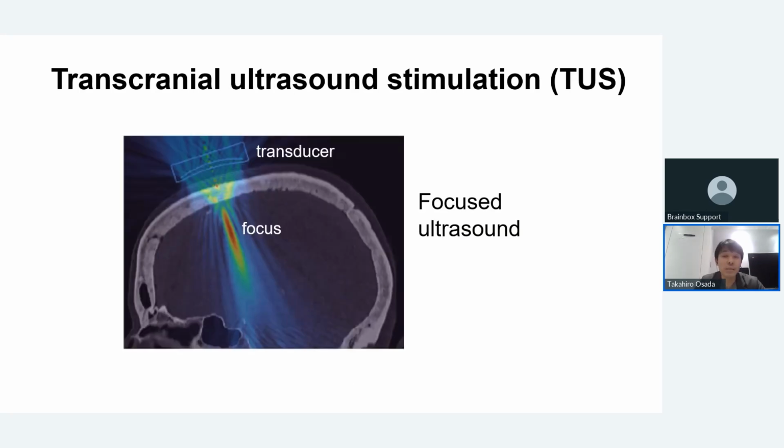This limitation of conventional NIBS can be addressed by using ultrasound stimulation. In particular, focused ultrasound enables selective stimulation of deep brain regions. This is achieved through acoustic waves generated by piezoelectric transducers. The ultrasound waves can be focused precisely at the deep brain location. This is used for non-invasive brain stimulation. This will be the main topic of this webinar.